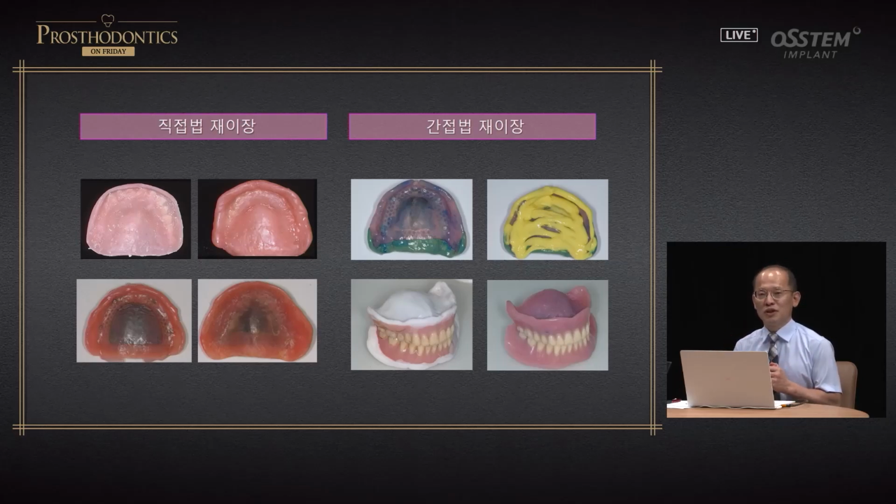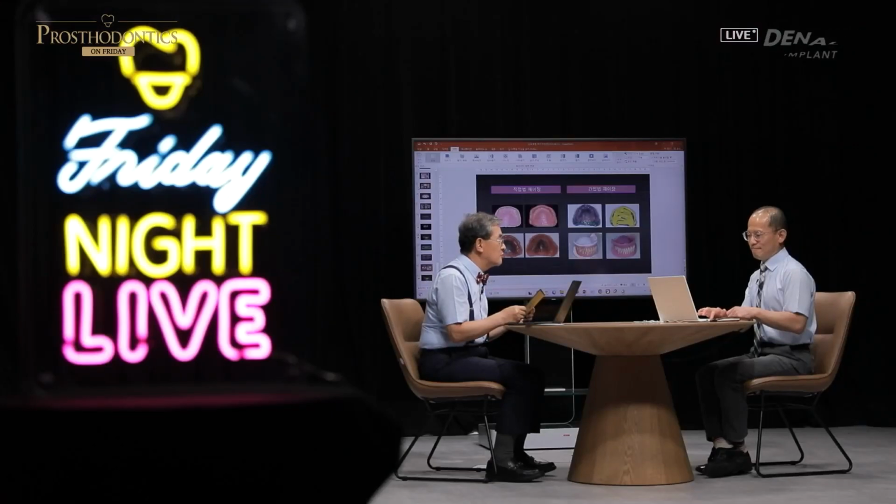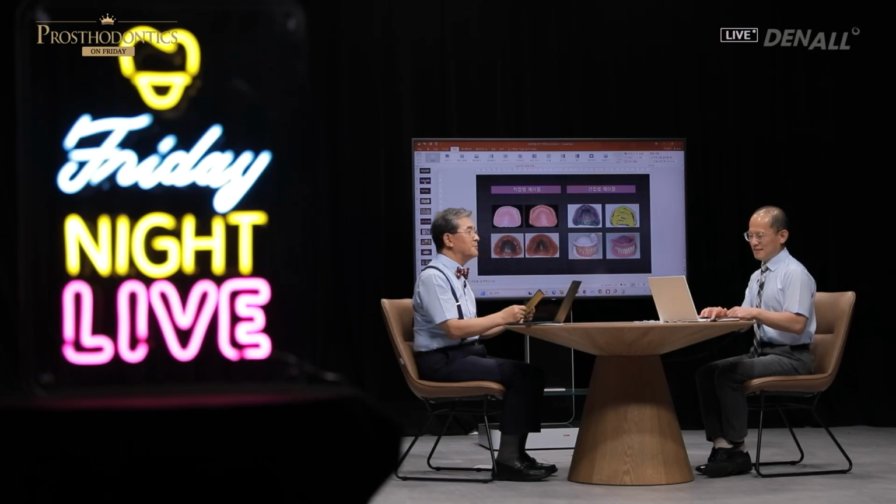And in terms of occlusal adjustment that you talked about, for local adjustment, direct relining is okay, but for overall adjustment, the occlusal force cannot be trusted. Hence, in some areas, there might be imbalance or thickness in some parts, so you have to do it separately. Occlusal adjustment is what you also need to do. So you have to do it, and of course check afterwards again. I also agree with that point. Thank you for that answer.